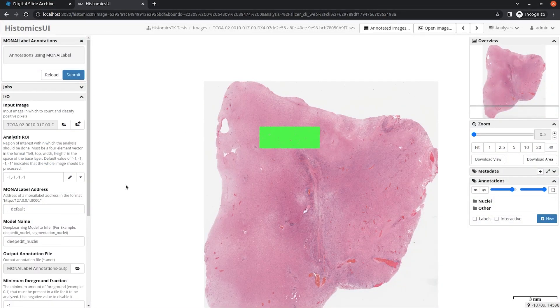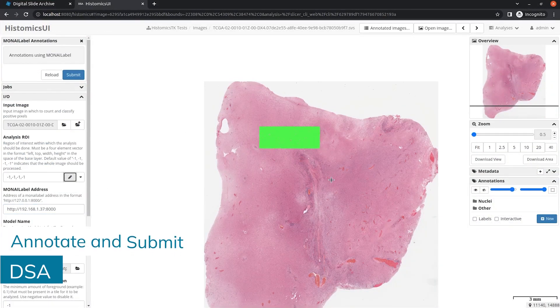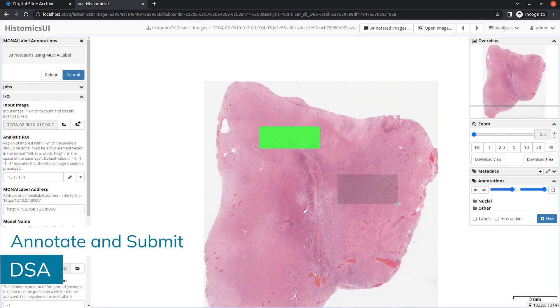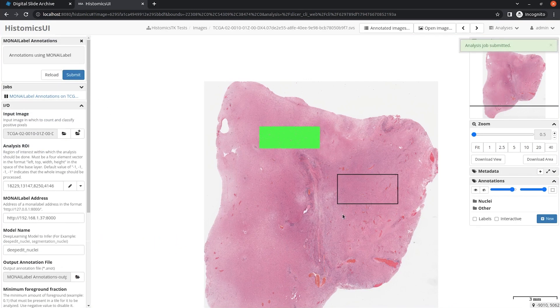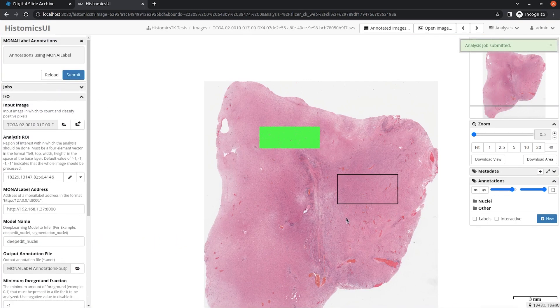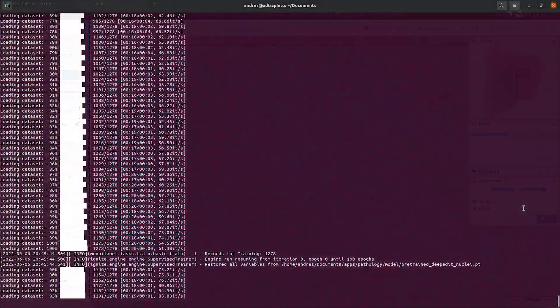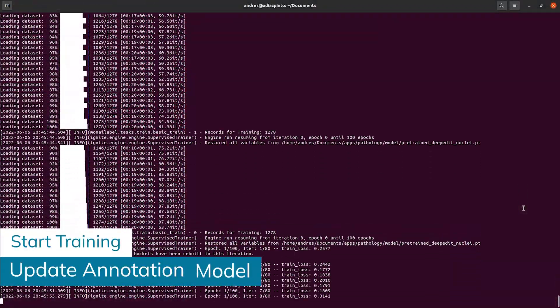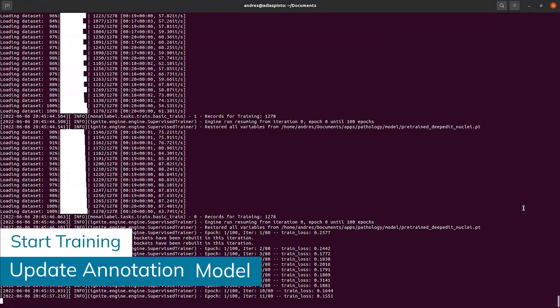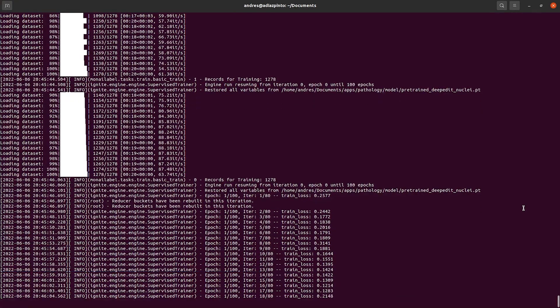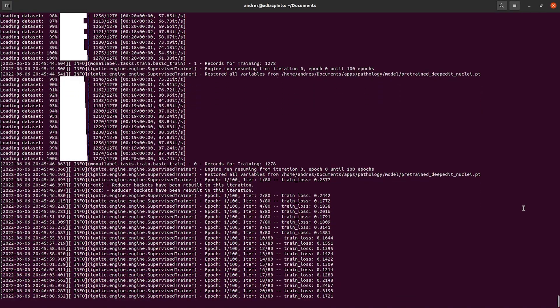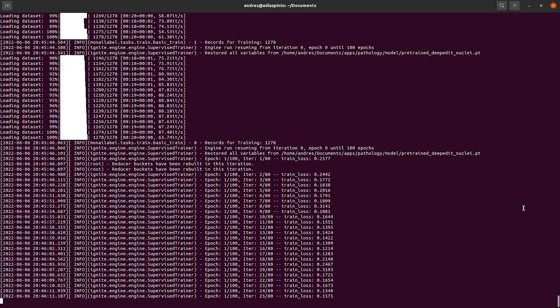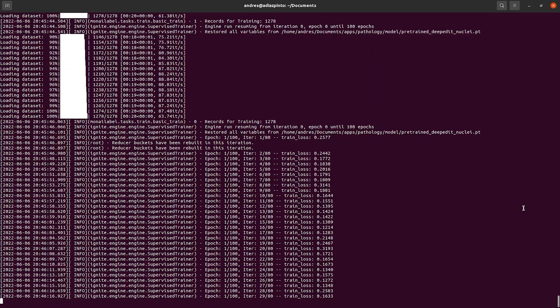You can select an ROI, run annotation, and submit the label to the MoniLabel server. Once you've labeled enough data, you can trigger training to update your model with your most recent annotations. Once that's done training, you can use that updated model to continue annotating.